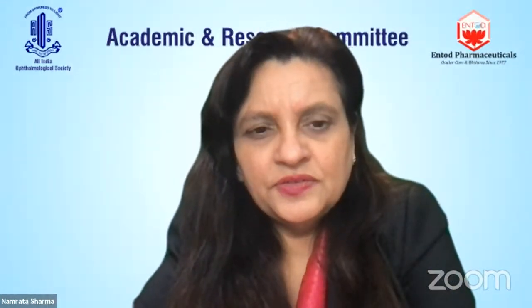Sorry, there's a connection issue here. Confident of the lens in the bag, I would not do a PI. No. Because if the lens is not in the bag, then I will do a PI.